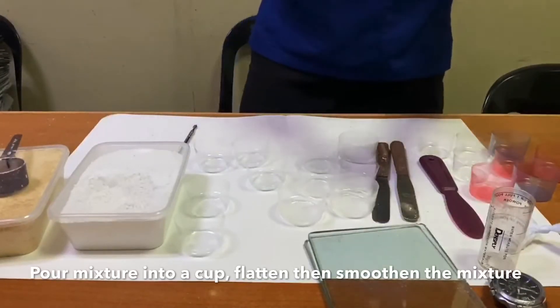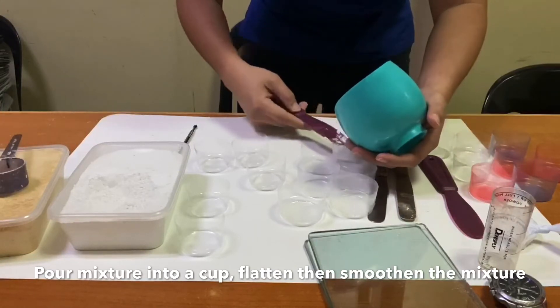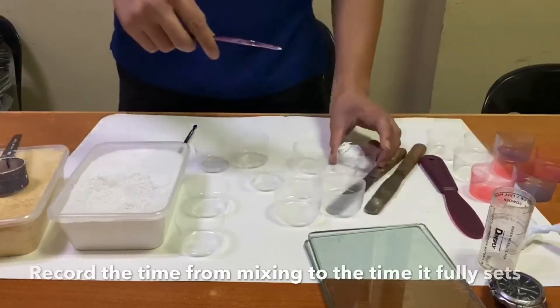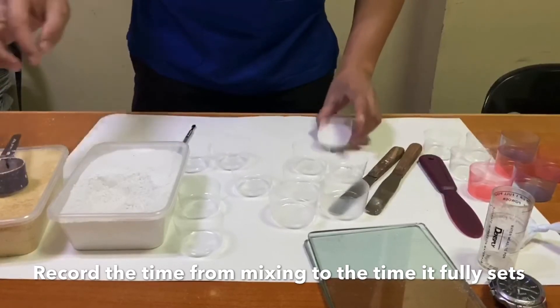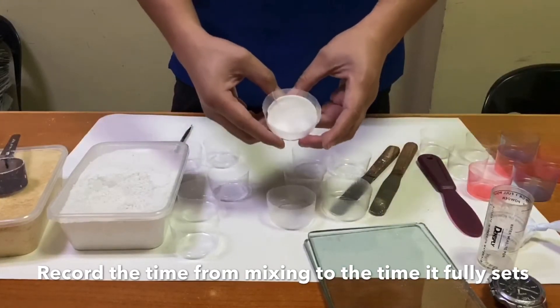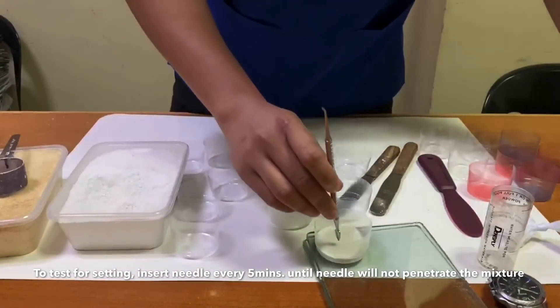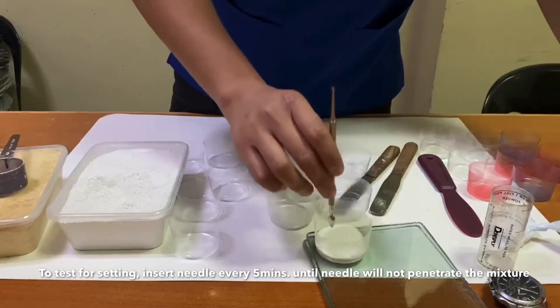After tapping, pour the mixture into the cup and then tap again to flatten and smoothen the mixture. To test the setting, insert a sharp object every 5 minutes until the needle or any sharp object will not penetrate the mixture anymore.